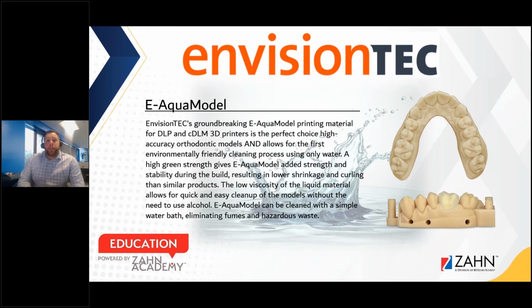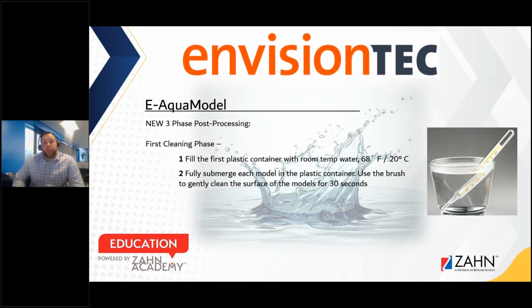So there are different changes in how we go about post-processing these models. There is a three-phase process that we're going to go through here, and this identifies the difference between the traditional method and the new process. With the first step, you place the water into a plastic container at room temperature.